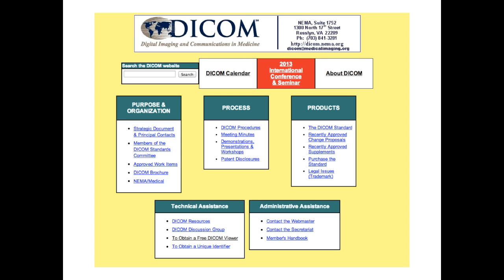DICOM is a very, very technical standard, and it's huge. It not only specifies the way that images are to be represented, it also specifies network operations for exchanging images. It specifies things like we talked about with the DICOM modality worklist and many, many other things. The standard is actually reasonably readable for normal humans, but finding the information that you want can be really challenging.